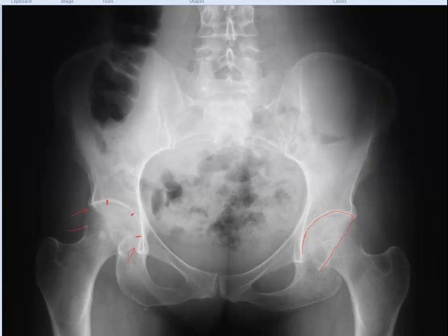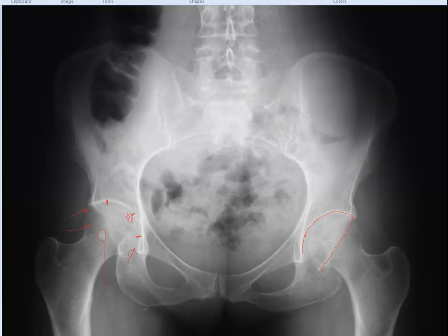This patient has a faint epiphyseal scar — notice this slight linear radiopaque opacity. This is where the growth plate used to be open, and it's normal to have a slight remnant of that scar. This particular patient also has a small bone island in their femoral head, which is an incidental finding. Continuing on with the femur, here's the fovea capitis — this is the insertion point for the ligamentum teres.